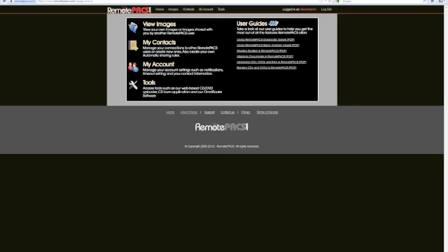So here's what I recommend for RemotePACS, and this is generally a pretty reasonable speed that's available almost anywhere in the U.S.: a minimum of a download speed of 5 megabits and an upload speed of 1. So obviously the faster the better, but most places in the U.S. can get that speed. If you're going to be reading or uploading a lot of studies, it does pay to look at maybe a faster internet connection than that even, but that's the minimum that I would recommend.